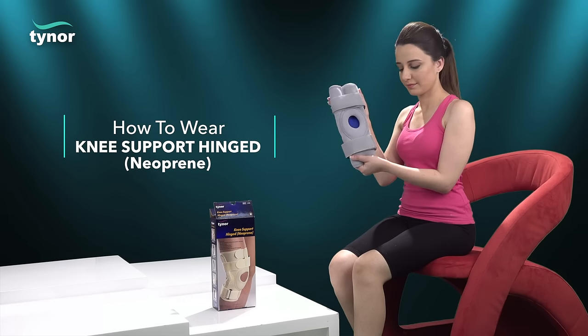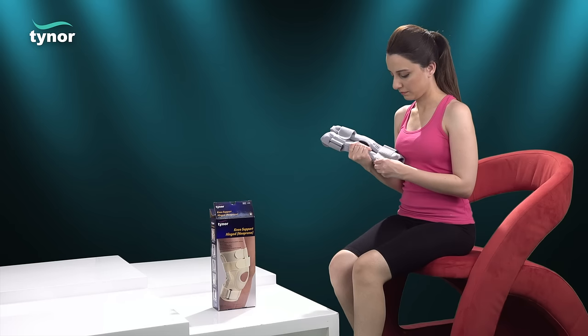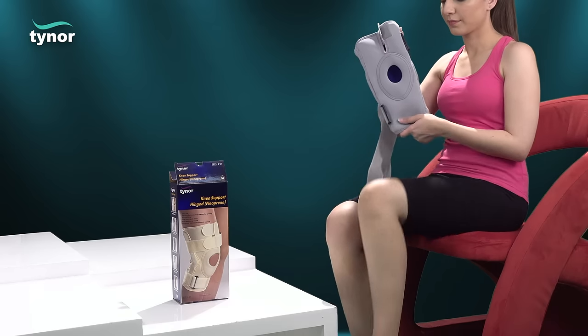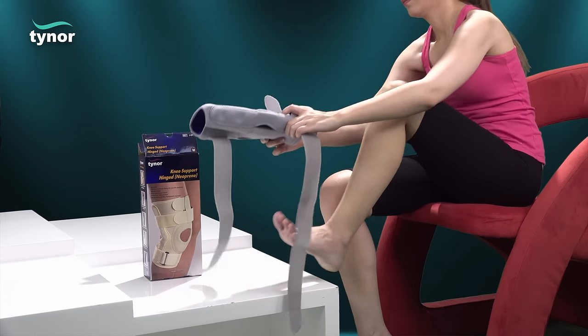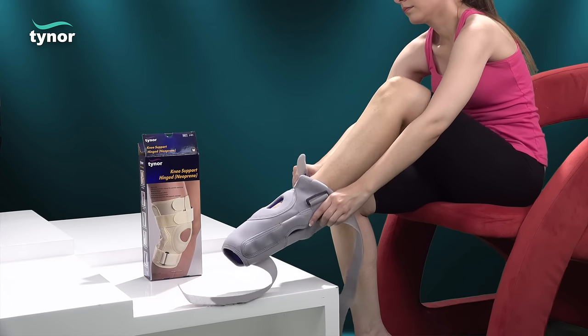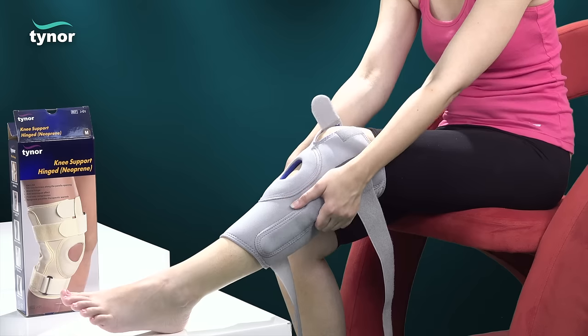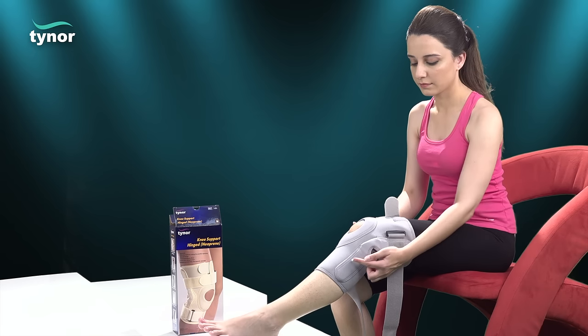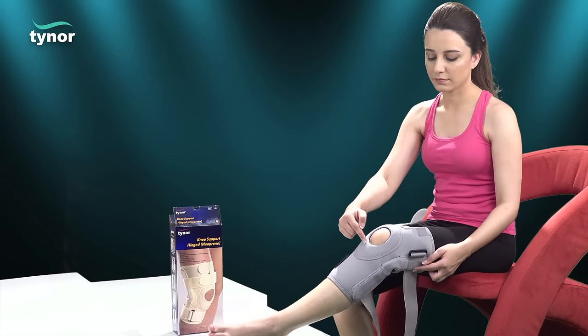To wear the knee support hinged neoprene, unfasten the hook-loop fasteners and apply the product with the wider side placed upwards using a pull-on action. To ensure proper use, the hinge fulcrum should align with the knee joint.